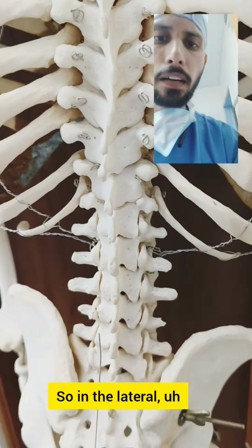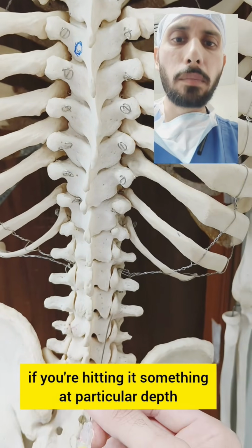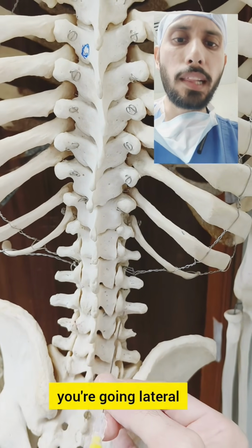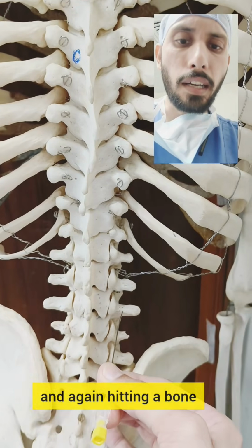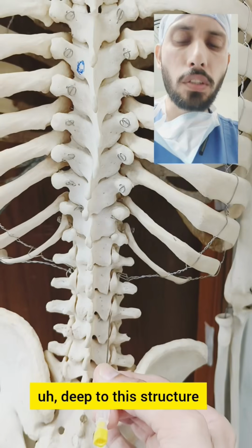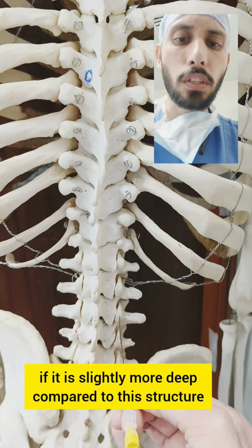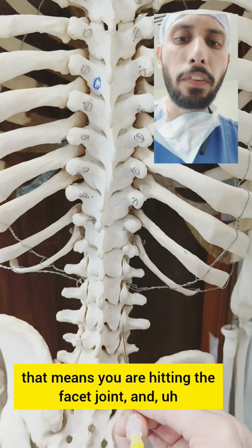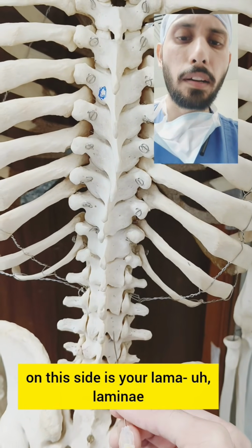So in the lateral direction, if you are not aware of the midline, and you hit something at a particular depth, then you go lateral and the needle gets inserted inside and again hits a bone, but it is slightly deeper than this structure. And again, if you go medially and it is slightly deeper compared to this structure, that means you are hitting the facet joint, and on this side is your transverse process, on this side is your lamina.